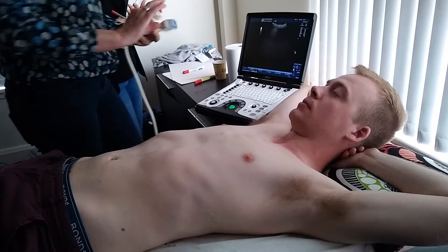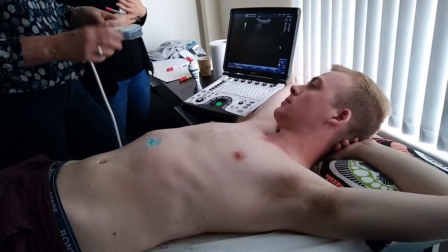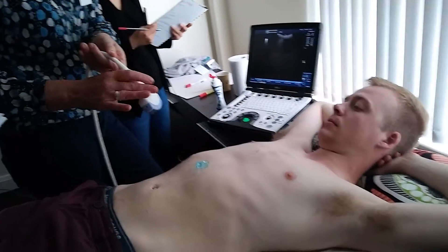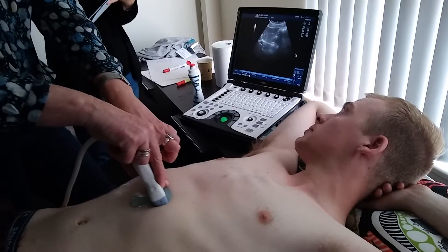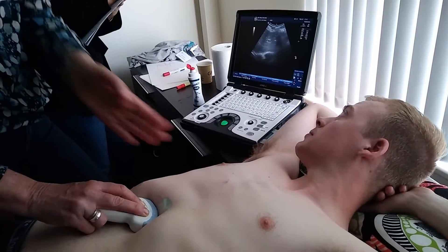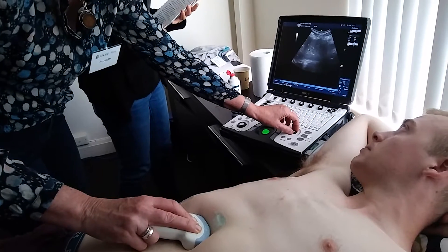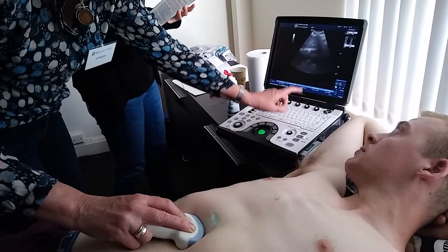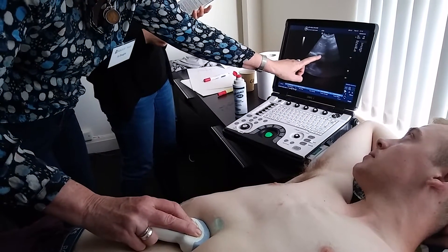The next thing is we're going to look for a pericardial effusion. You can see my hand movements aren't big - they're pretty small. I'm going transverse, so the marker's going to the patient's right. I'm going to pick up my hand and make sure it's put on like this. Transverse - I slide away from his xiphoid here a little and I'm angling up to the heart. There's a lot of depth because I'm trying to go through the liver, through the diaphragm, to his heart. You can see there's liver and there's his heart down there. So this is his right ventricle and left ventricle, and we'll be looking for fluid around the outside here.